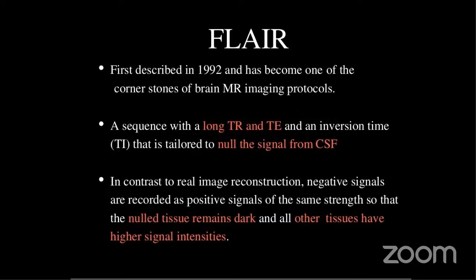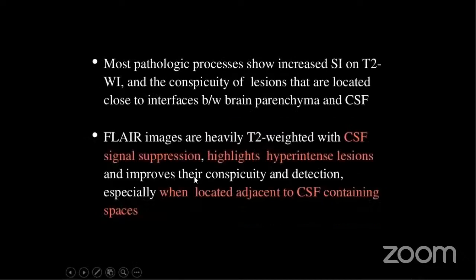In contrast to the real image reconstruction, negative signals are recorded as positive signals of the same strength, so that the nullified tissue remains dark and all other tissues have higher signal intensity, right? So nothing else changes, only the fluid, the CSF, is suppressed.